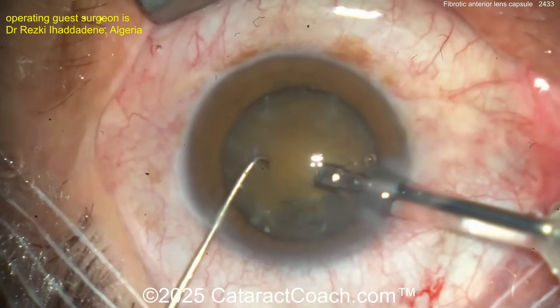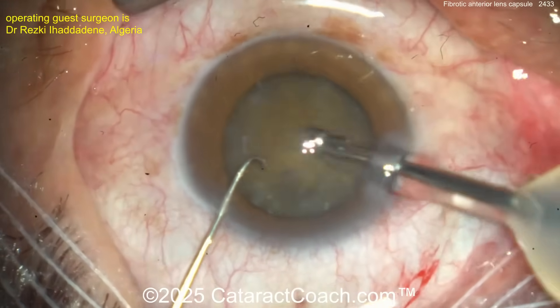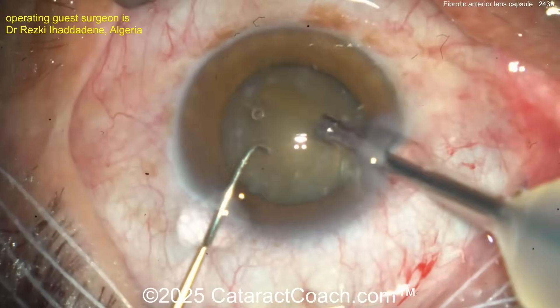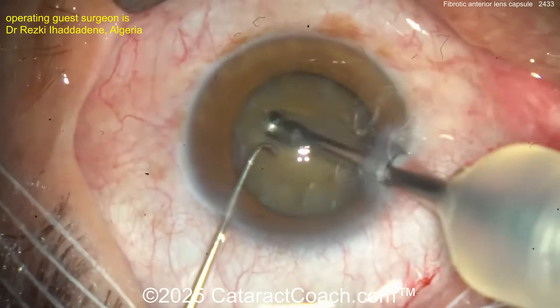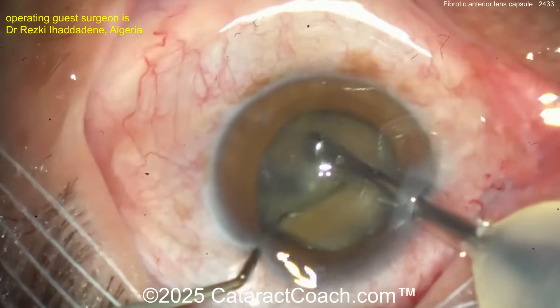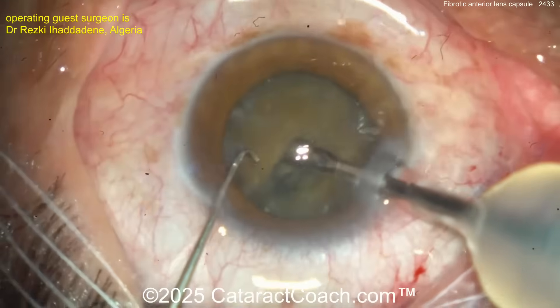Now it looks like a sharp chop on the left hand — maybe a vertical chop technique. Let's see — maybe a groove, maybe a submarine chop, or a stop-and-chop. You can debulk the central part of the nucleus, which is the densest part. There's the split — beautiful split! Nice-looking stop-and-chop.